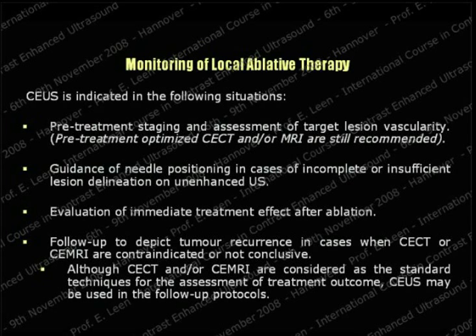Now, as you can see here, there's another sub-statement. Although CT-MR is considered the gold standard, we do recognize that CEUS, especially in the case of hepatoma monitoring, has a great value in terms of follow-up protocols.